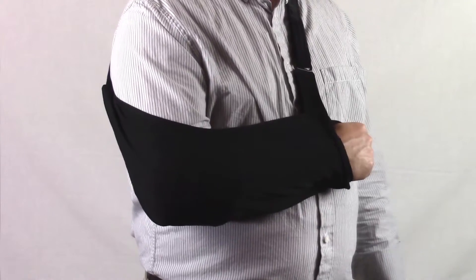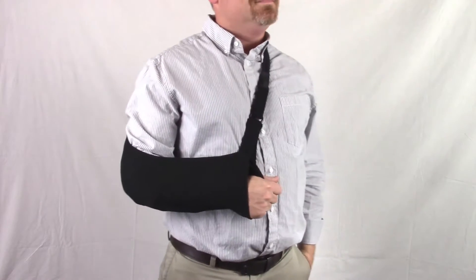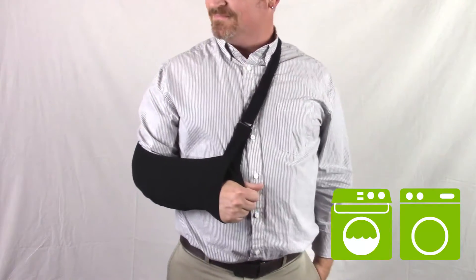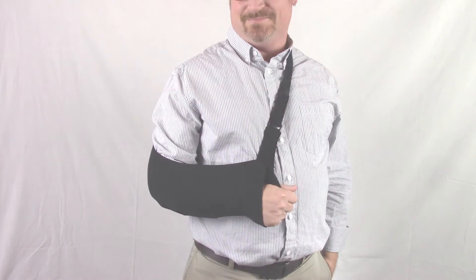Comfort is a priority with no pressure points on your elbow or wrist. The Ultimate Arm Sling is made of an easy-to-care-for material that can be machine washed and dried. The Jocelyn Ultimate Arm Sling is designed to provide extraordinary comfort to aid your recovery.